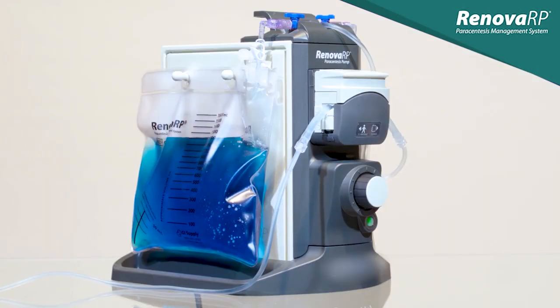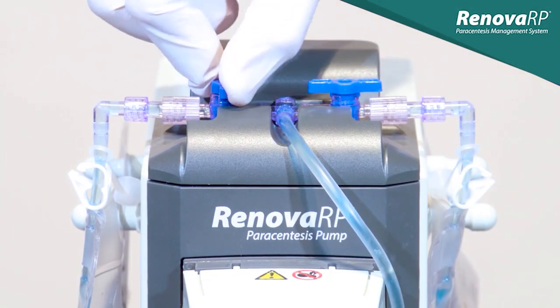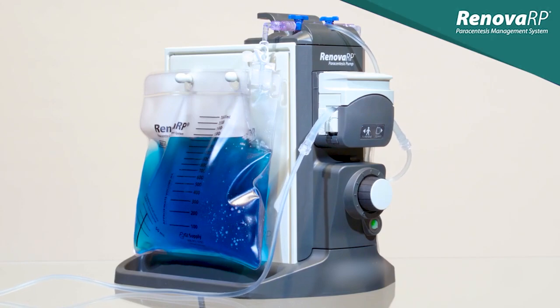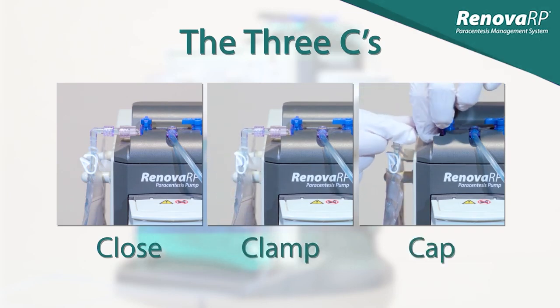Another important point where errors have occurred is when changing the bag. Before clamping the full bag, the stopcock on that side must be closed. If fluid is still flowing in the bag when it's clamped, the pressure of the fluid will put stress on the bag connector and increase the risk of fluid exposure. Use the three C's to help prevent this error: close the stopcock, clamp the bag, then remove and cap.